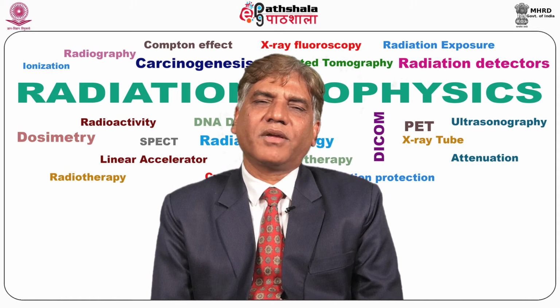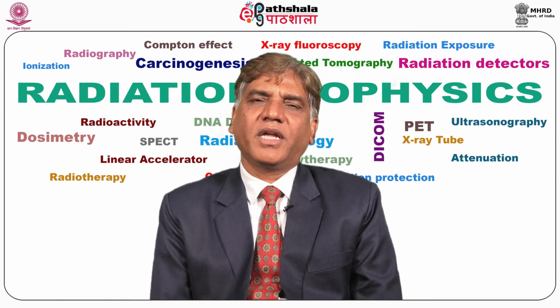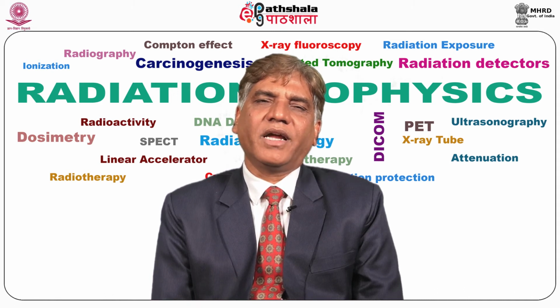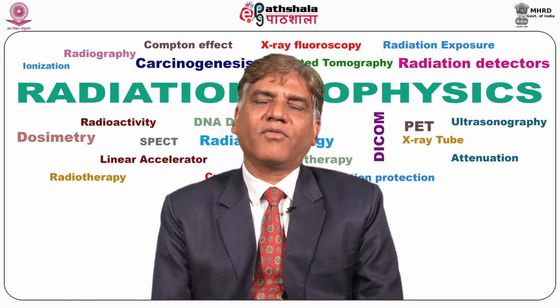As you can see here in this figure, during exposure the TFT is switched off, and charge is accumulated and stored. After exposure termination, TFT array activation occurs, turning on the gate lines, and the accumulated charge in the capacitor flows through the transistor to the drain line using multiplexers. Subsequently, it is connected to a charge amplifier, voltage conversion and digitization take place. Voltage is then converted back into grayscale value at the display stage.